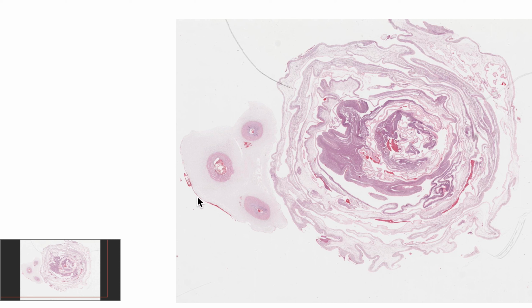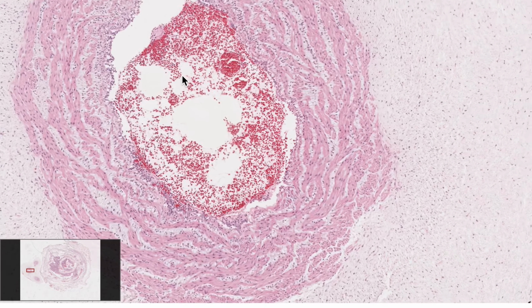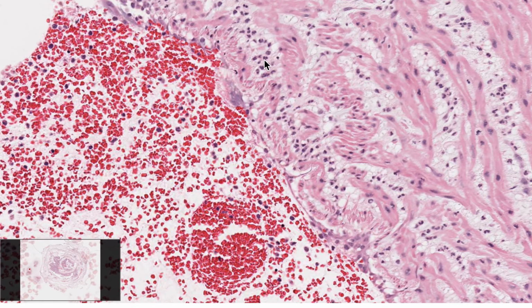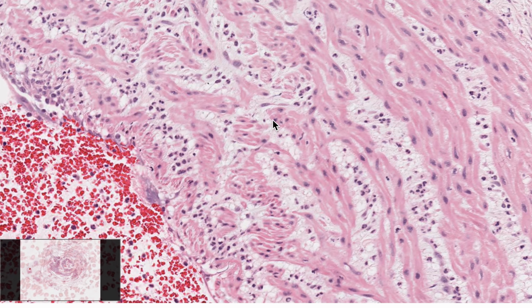So now let's go to the umbilical cord, where we see two umbilical arteries and one umbilical vein. And I like to distinguish the umbilical arteries from the vein because the arteries have two different orientations of the medial, or smooth muscle, layer of the vessels, kind of 1, 2, and then the vein just has one orientation. So let's go to the vein first. So the vein, this is the baby's blood, and these are the baby's neutrophils, and they marginate, or move, from the intimal layer to the media, and you can see these neutrophils. So this is acute phlebitis, at least.